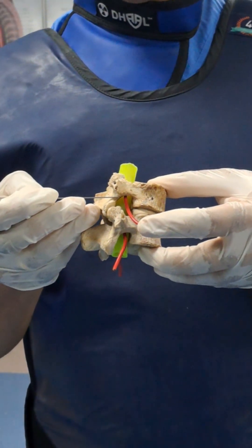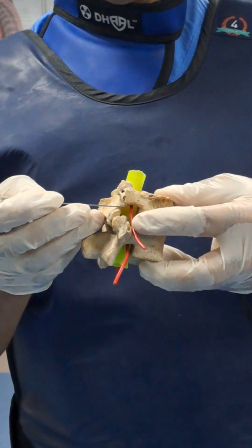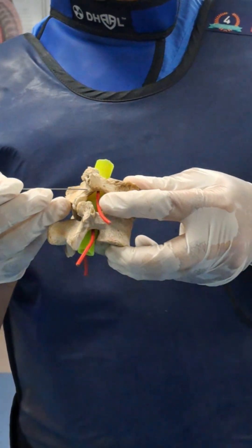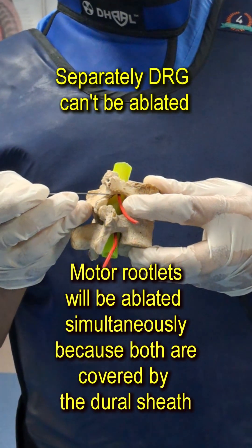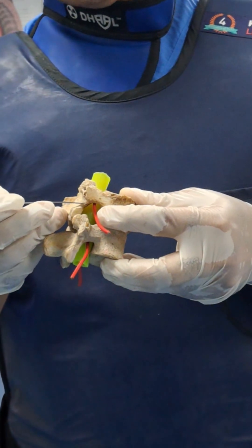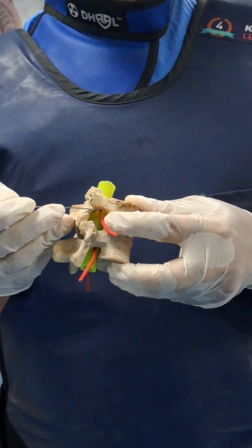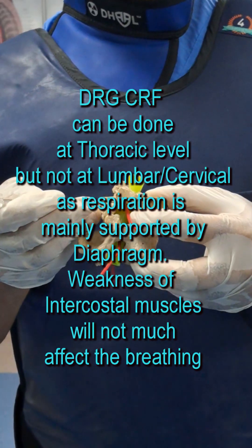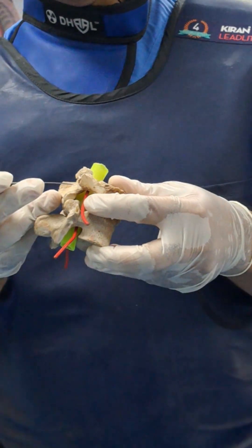Come to lateral view and, watching the depth, slowly advance the needle inside so you can keep it behind the dorsal ganglion. Then stimulation is done. In the lumbar level we do pulse radiofrequency because not only the dorsal ganglion is there but also motor rootlets, covered by the dural sleeve. When keeping the needle posterior to the dural sleeve, you are burning both sensory and motor rootlets simultaneously, which may cause motor weakness. Conventional RF is therefore not recommended for lumbar and cervical DRG RF, but can be done specifically at the thoracic level for post-herpetic neuralgia or other indications.